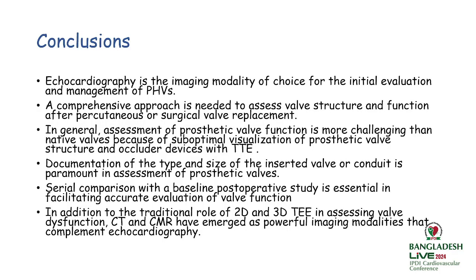mmHg. In conclusion, echocardiography is the imaging modality of choice for the initial evaluation and management of prosthetic heart valves. A comprehensive approach is needed to assess valve structure and function after percutaneous or surgical valve replacement. In general, assessment of prosthetic valve function is more challenging than native valve because of suboptimal visualization of prosthetic valve structure and occluder device with transthoracic echo, which can be overcome by transesophageal echo. Serial comparison with a baseline postoperative study is essential in facilitating accurate evaluation of valve function. In addition to the traditional role of 2D and 3D transesophageal echo in assessing valve dysfunction, CT and cardiac MR have emerged as powerful imaging modalities that complement echocardiography.